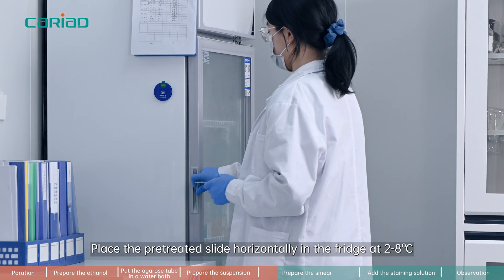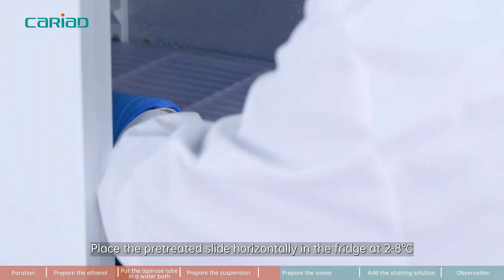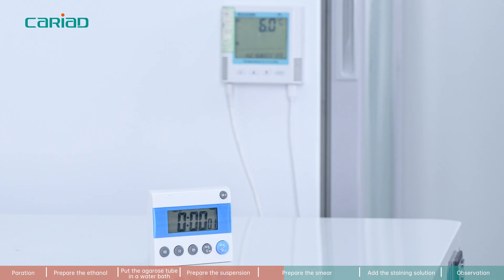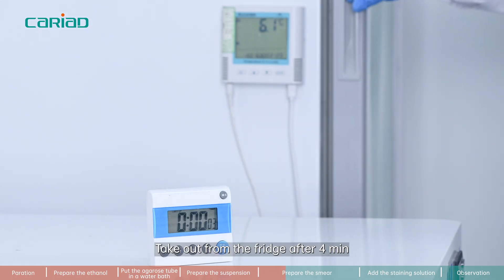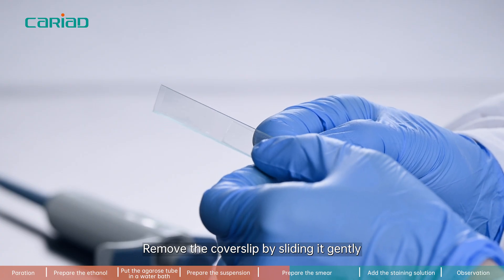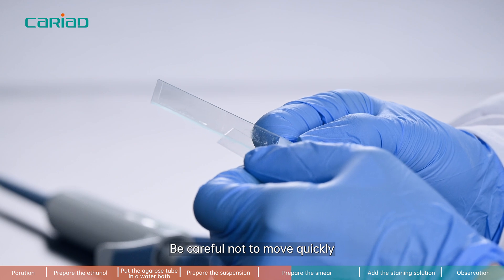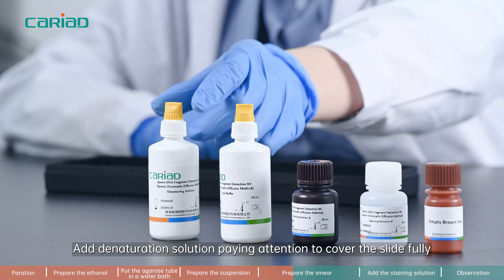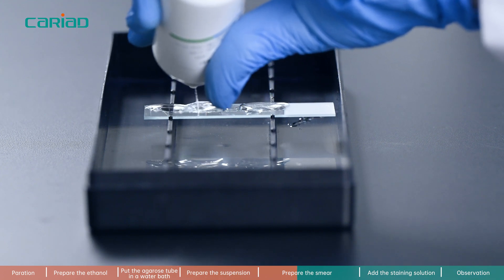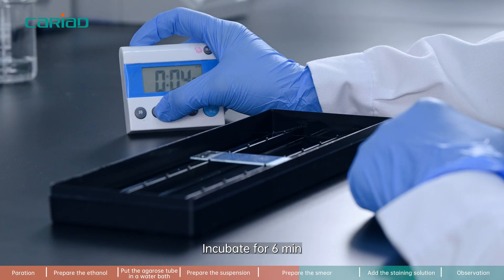Step 6. Place the pretreated slide horizontally in the fridge at 2 to 8 degrees Celsius. Take out from the fridge after 4 minutes. Remove the coverslip by sliding it gently — be careful not to move quickly. Add denaturation solution, paying attention to cover the slide fully, and incubate for 6 minutes.